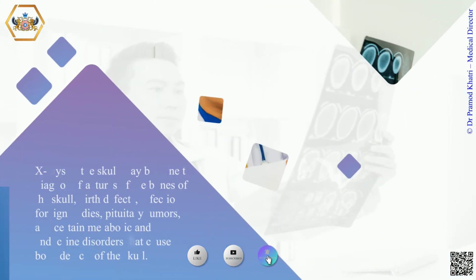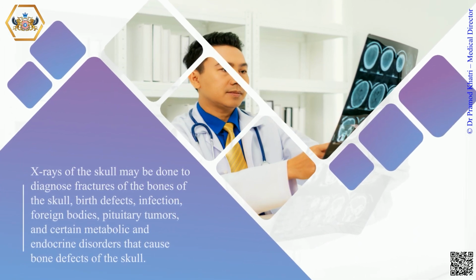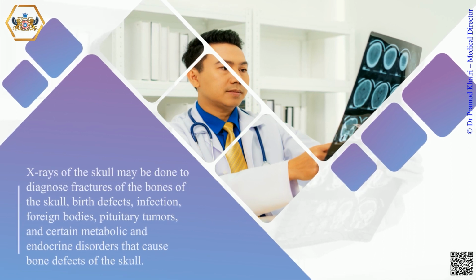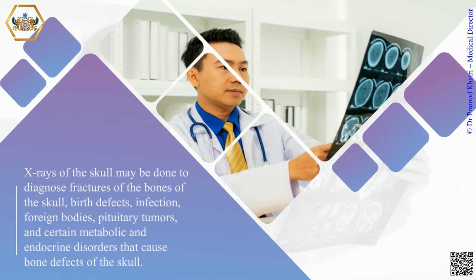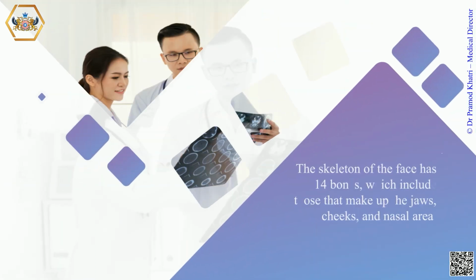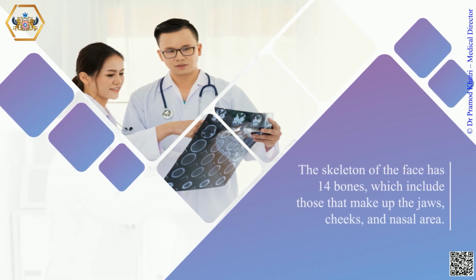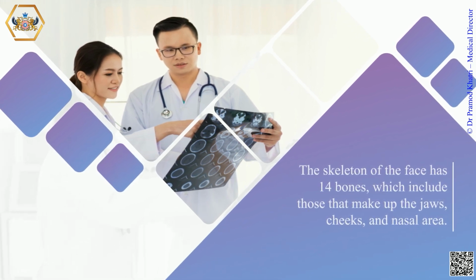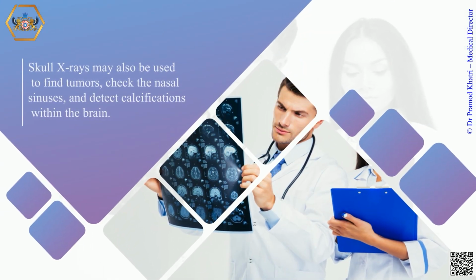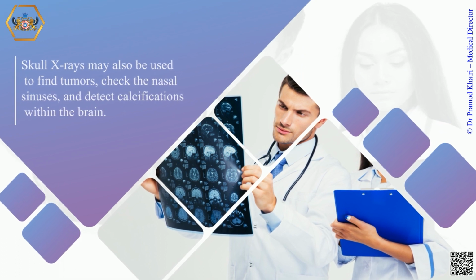X-rays of the skull may be done to diagnose fractures of the bones of the skull, birth defects, infection, foreign bodies, pituitary tumors, and certain metabolic and endocrine disorders that cause bone defects of the skull. The skeleton of the face has 14 bones, which include those that make up the jaws, cheeks, and nasal area. Skull X-rays may also be used to find tumors, check the nasal sinuses, and detect calcifications within the brain.